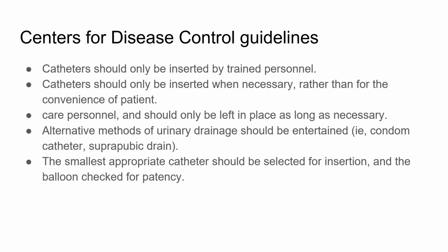We have identified different sizes of catheters. If you remember, we have identified the small catheters, the medium catheters and the larger catheters. Depending upon the French units, that is 12 to 14 French units for the smaller catheter, 16 to 18 French units for the medium catheter and 20 to 24 French units for the larger catheter. We also have the conditions where they are used: 12 to 14 French units for strictures, 16 to 18 for adult males, and 20 to 24, the bigger ones, are used for prostatic hypertrophy and hematuria.